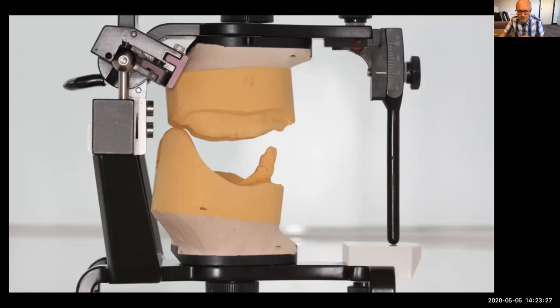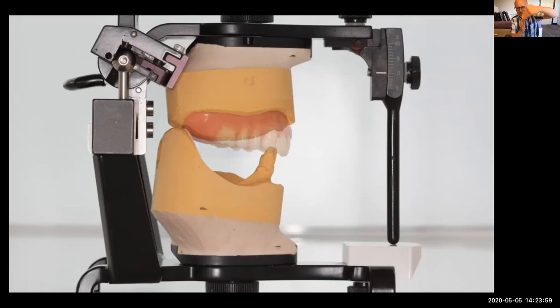So she's got the full upper denture in place, and this is her denture in. This is her model. The interesting thing about Anne was she was an artist, and her previous denture, the one that we replaced, she'd actually set her teeth up herself. She wanted porcelain teeth in the maxilla as well, because she wanted the sound when she was biting, the little chink of porcelain onto natural teeth. She didn't want a dull sensation or sound like acrylic does. So I said to her, yeah, we'll do them with ceramic.